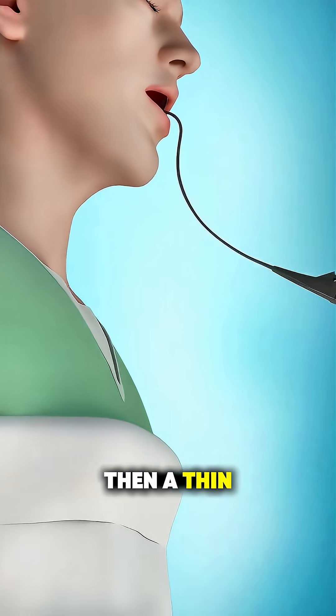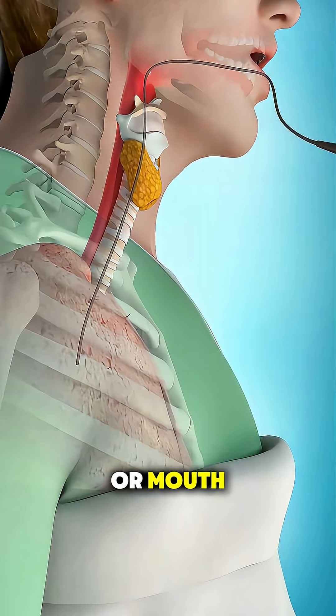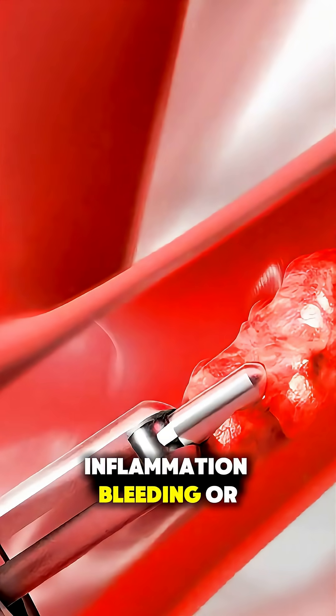Then, a thin, flexible tube called a bronchoscope, fitted with a camera and light, is gently inserted through your nose or mouth, down your throat, and into your lungs. This lets the doctor see any blockages, inflammation, bleeding, or infections inside your airways.